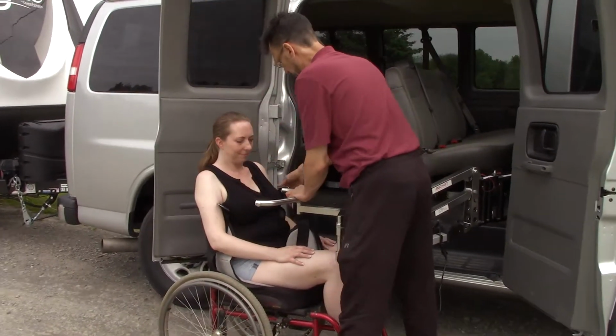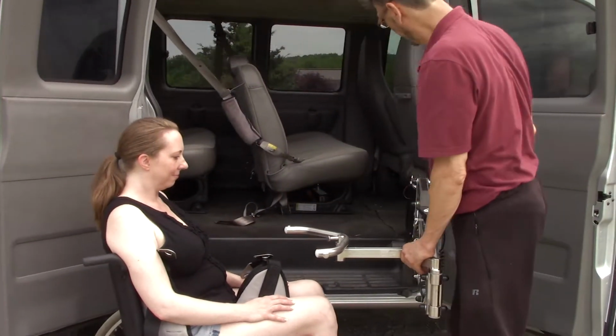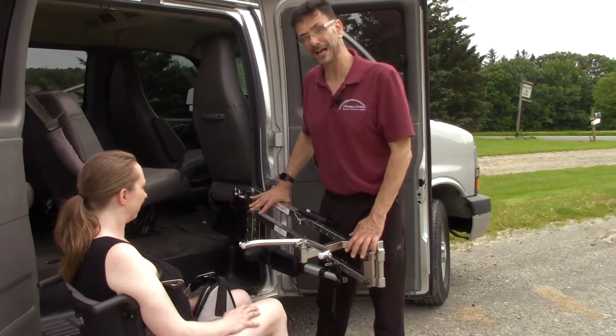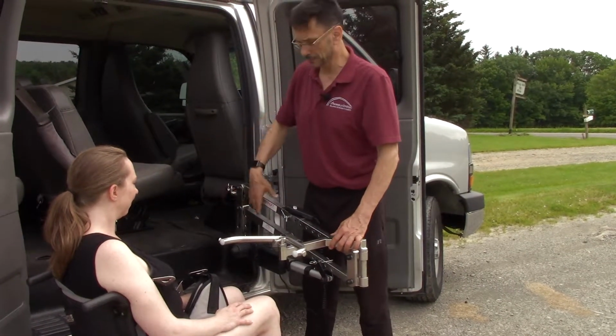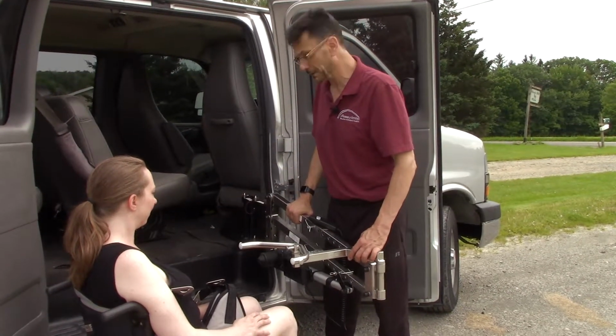Once the tension is off the straps, we release and we are ready to hit the road. You can actually take the lift, if there are tie downs provided with the system, which is an option. Then you would simply swing the lift in, tie it down for safety during motion.